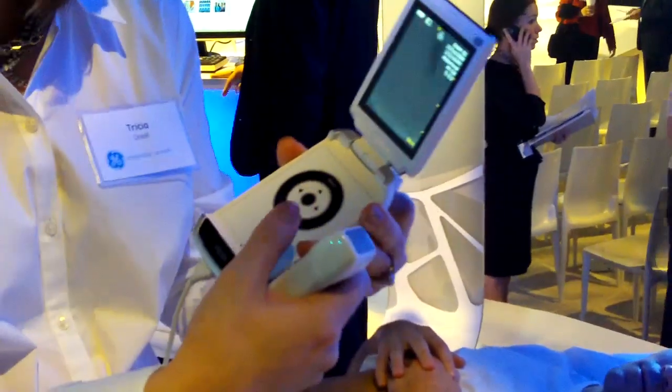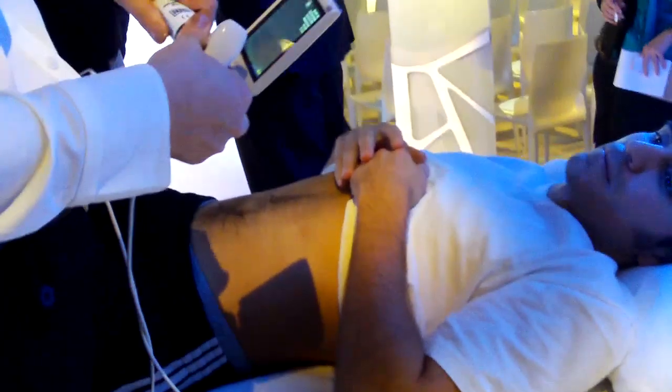It's for the right hand — thumb operated, so it's flexible that way. I'm just going to put a little gel on.